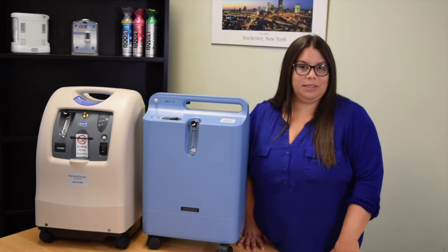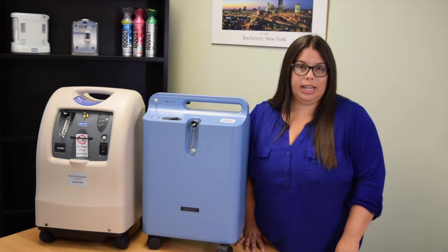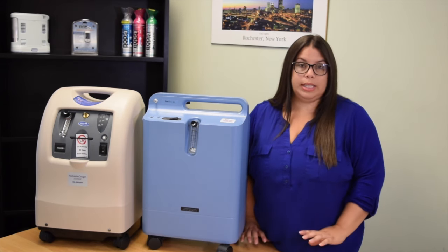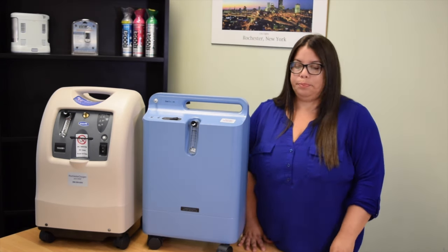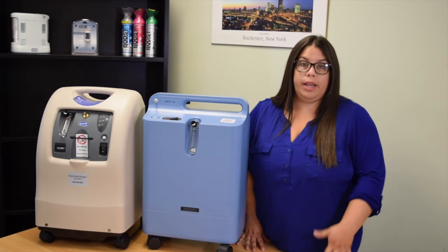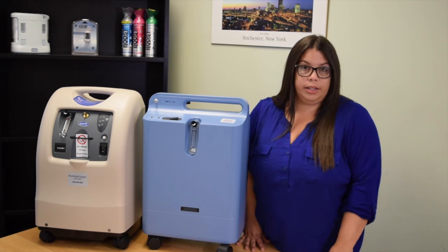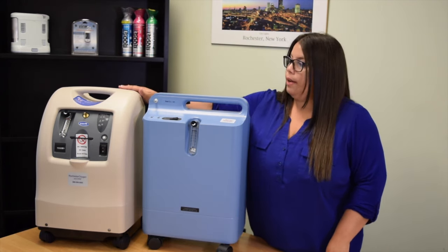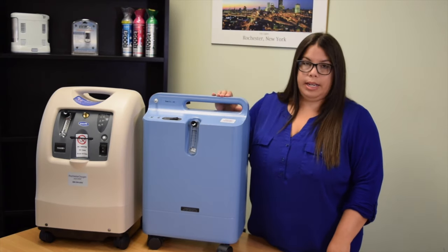Hello, my name is Kathy Liz de Villa and I'm a respiratory coordinator. In this video I'm going to be showing you how to set up your oxygen concentrator. We carry a variety of concentrators and they all work very similar. Here we have the Perfecto O2 and the Respironics Everflow.